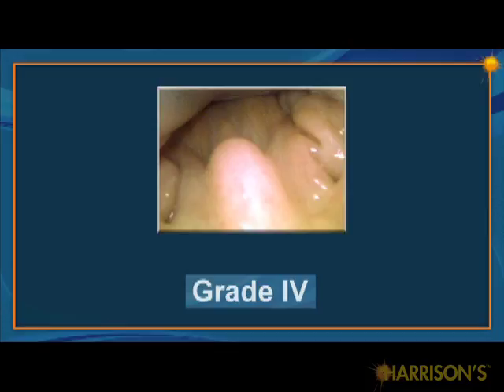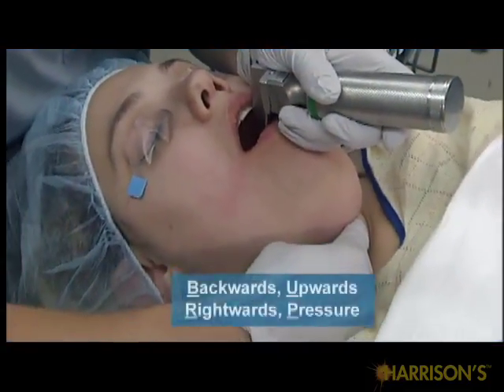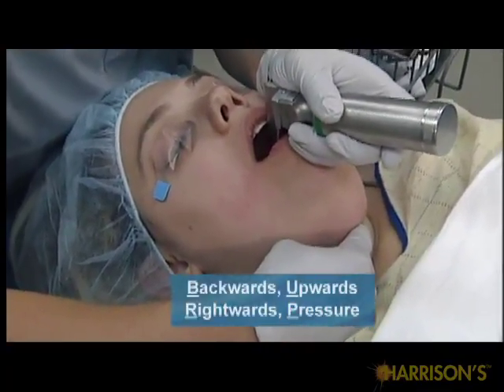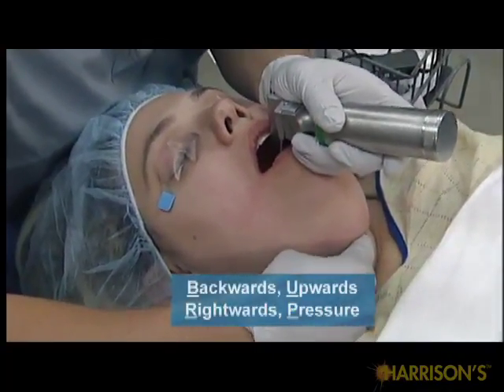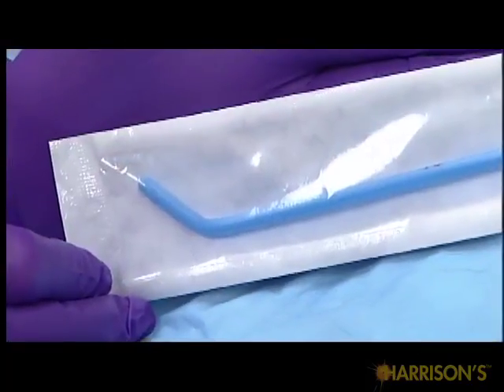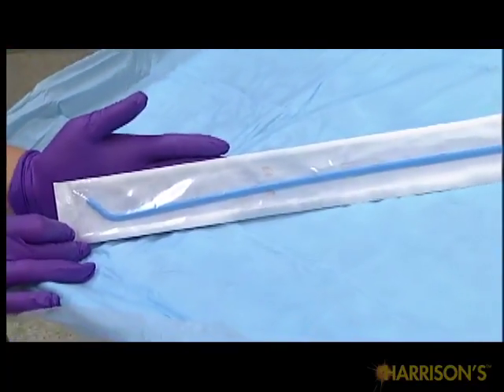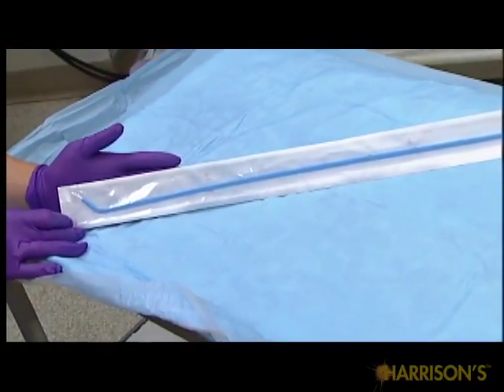If the view of the cords is still suboptimal, troubleshooting is necessary. Often burp or backwards, upwards, rightwards pressure can be applied by the practitioner to the trachea to improve the view. In addition, if the practitioner is able to see a grade 2 or 3 view but unable to pass the endotracheal tube, use of an Eschmann stylet or a bougie, which is a long plastic stylet with its end curved anteriorly, may be considered.